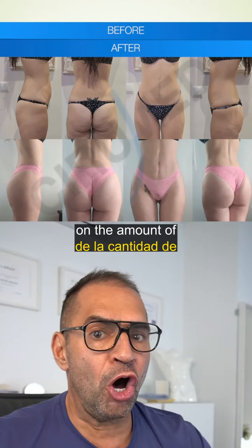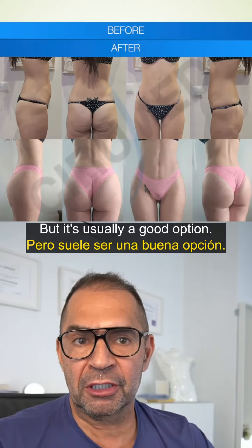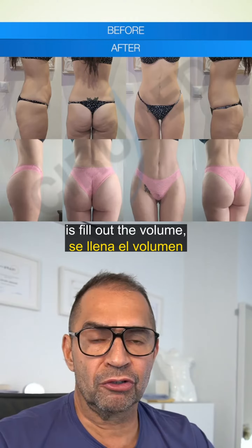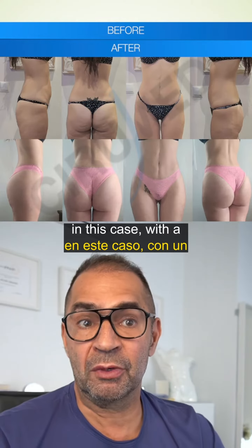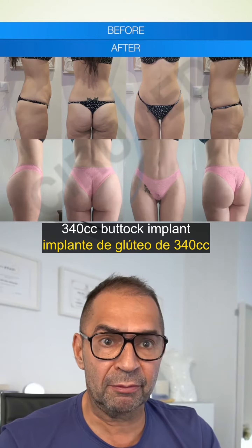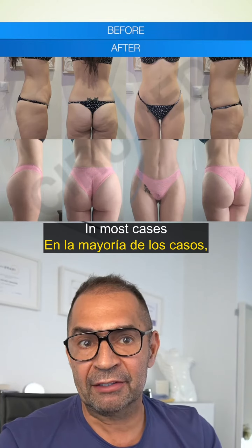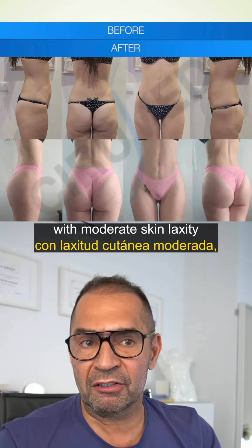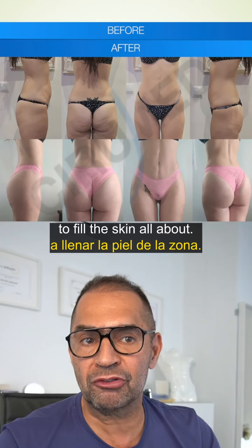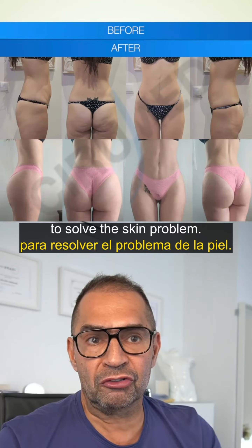It really depends on the amount of loose skin you have, but it's usually a good option — and this is what we show in the case here — is to fill out the volume. In this case with a 340cc buttock implant with EBL fat grafting to the hips, which in most cases with moderate skin laxity will help to fill the skin envelope out, and then we have a good shape and solve the loose skin problem.